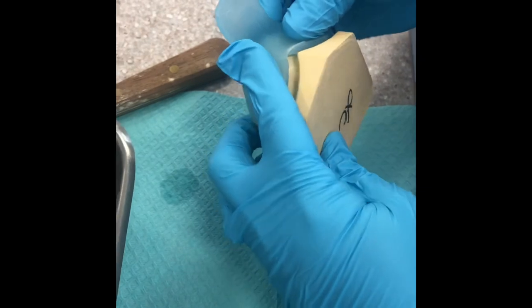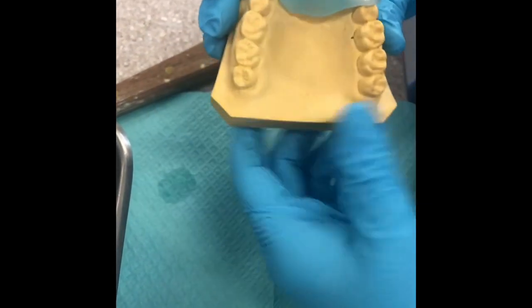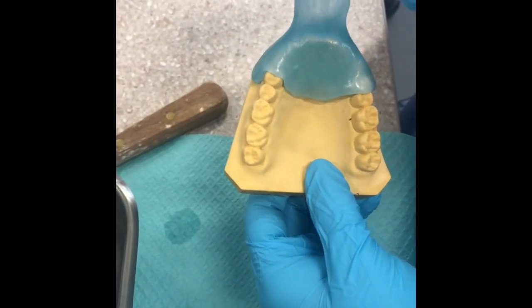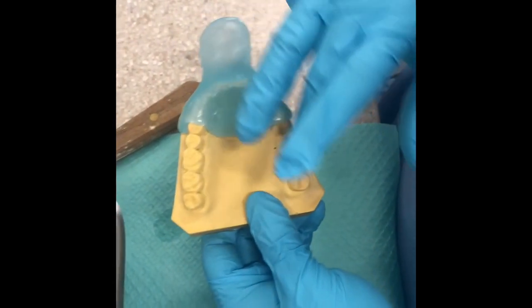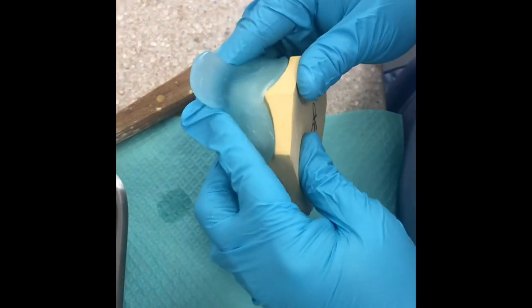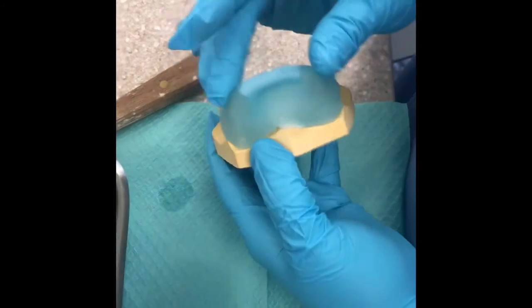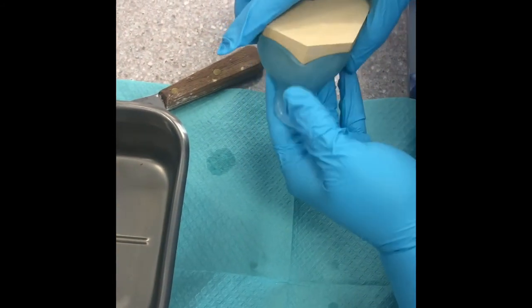This is just for a quadrant anterior tray. For a full arch custom tray, you'd need about two to three scoops. This is just one style, doing just the anterior, and when finished it should look something like this.